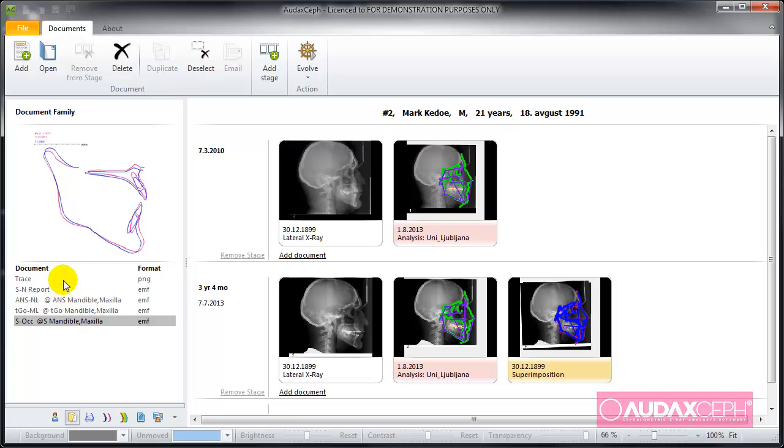If we want and if we have another analysis, we can drag it over this superimposition here and it assembles automatically.